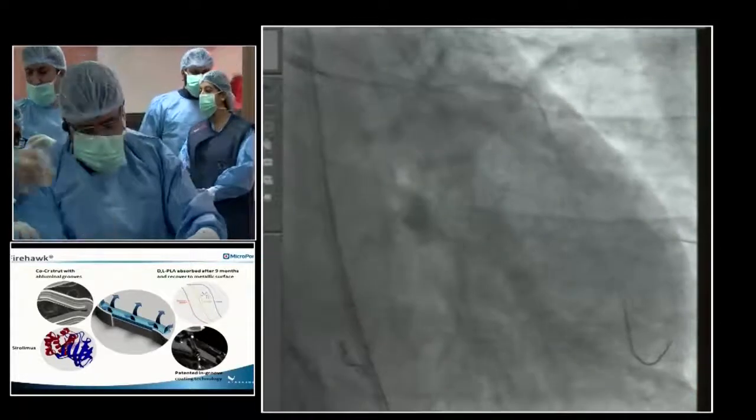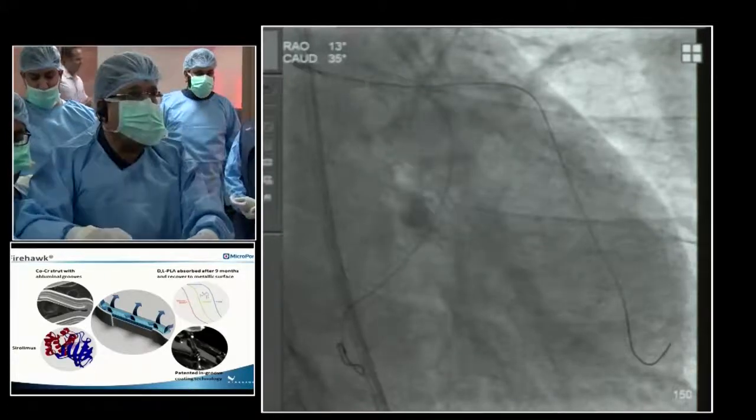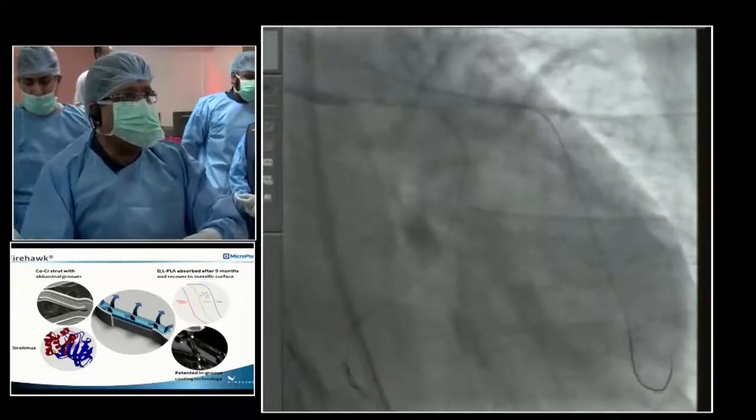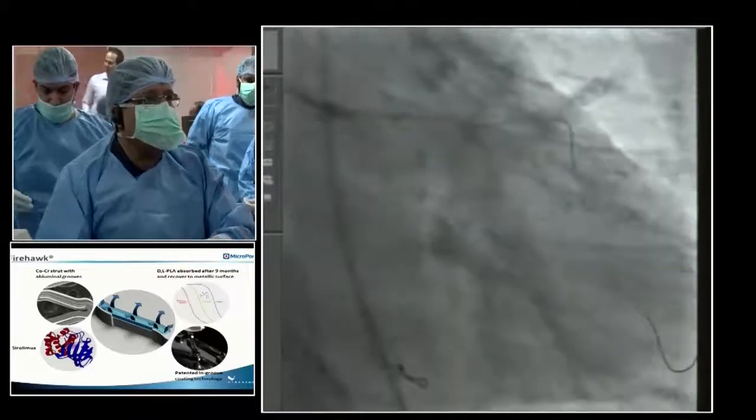And this is a common thing, which we can see here. We see that the wires have got twined. Now, how to get over this twining of the wires? Yeah, there's some twisting there. Anybody has any bright idea about it?